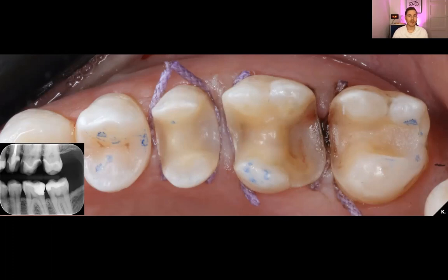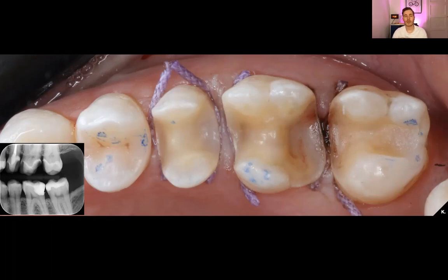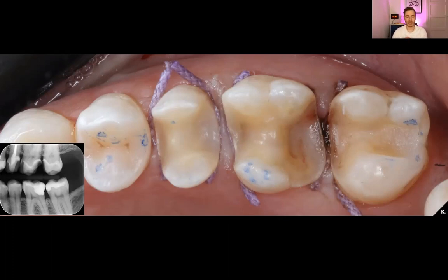In this case I use the Best Cord by CircaMath — it's one of my favorite cords and I always use this purple one. After placing the retraction cord you can still see a bit of contamination by blood. I can remove that with a slightly wet micro brush and then take my impression. On the lower left you can see the x-ray after the deep margin elevation is done.